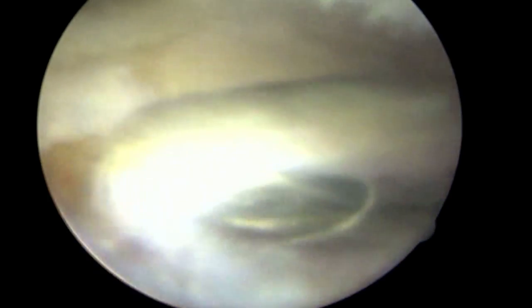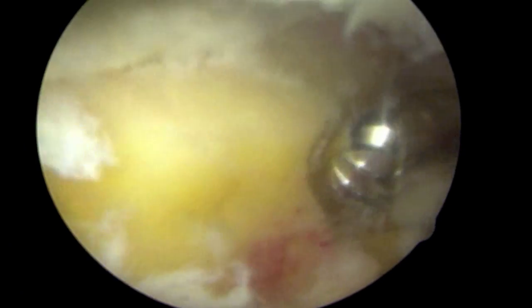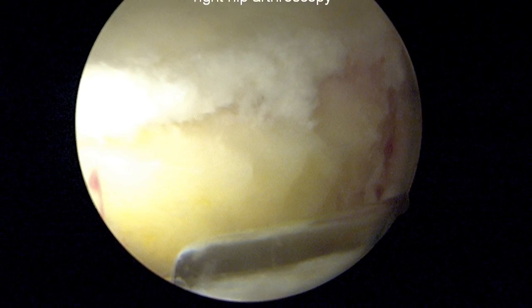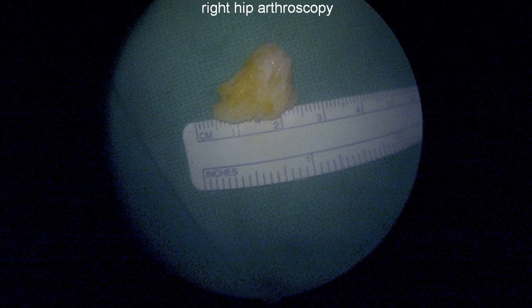After finishing the reshaping of the bone of the acetabular rim using the burr, one can then see the final product, which is a reshaped contour of the rim onto which the labrum can be reattached.